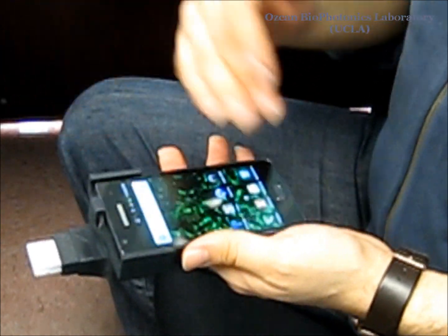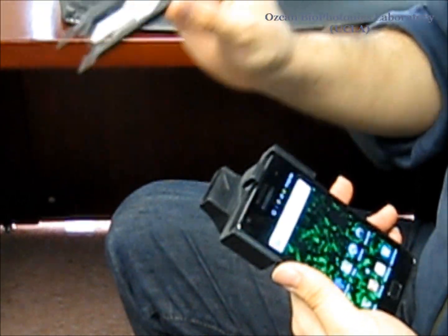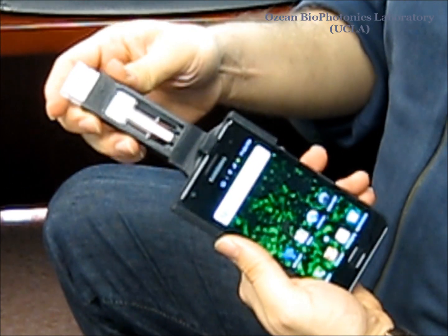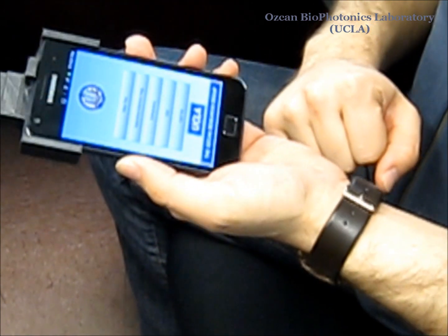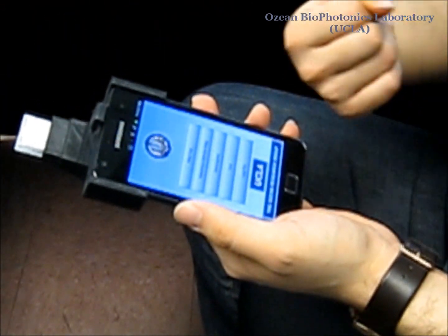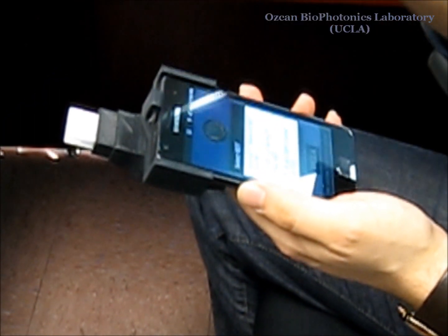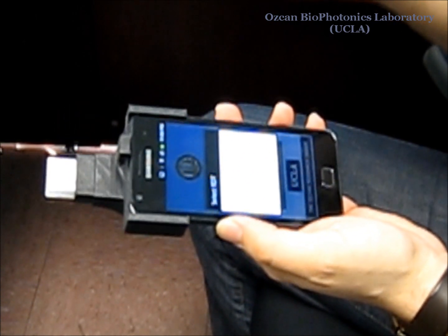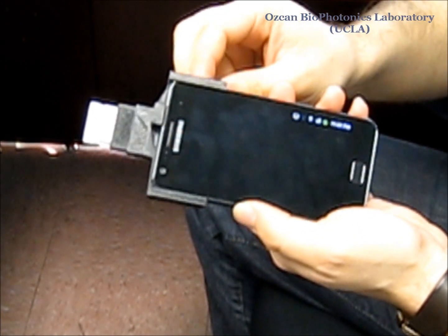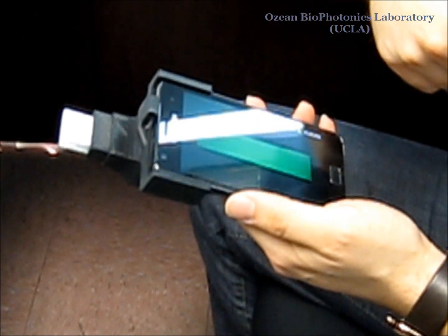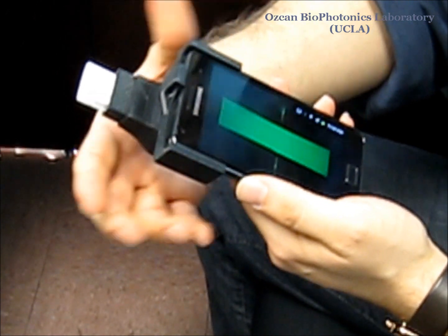Now let's look at how this works closely on the screen of the cell phone. This is a simple mechanical adapter that works with different rapid diagnostic tests. Once the healthcare worker uploads it, we start a new test and run our application for analyzing the rapid diagnostic test. You can start a new test and select which rapid diagnostic test you have inserted — in this case, malaria.